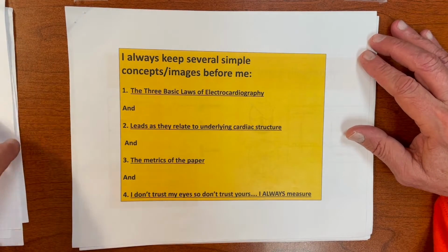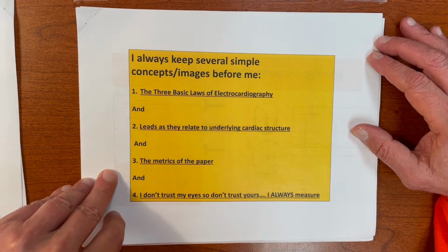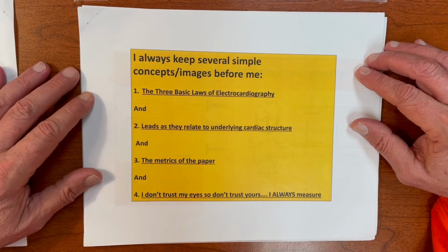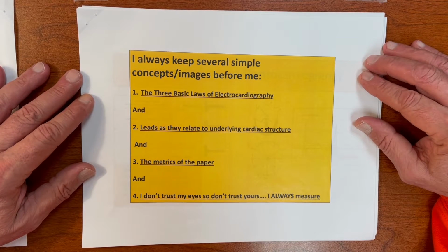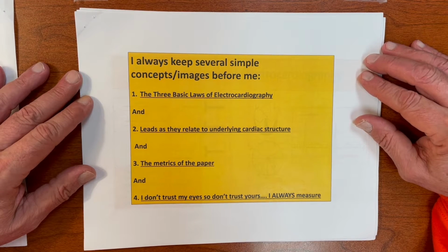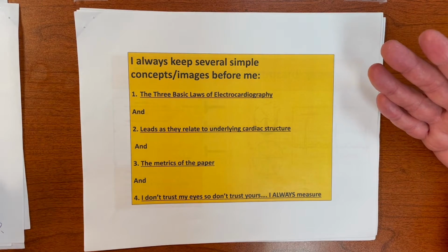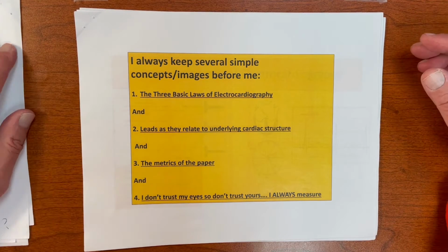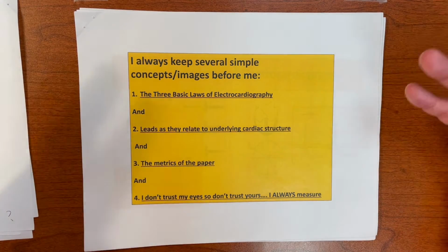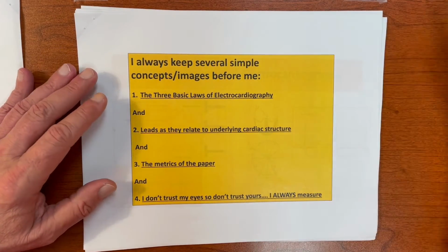So this is it, some very basic concepts. Not to insult anybody, but they actually are very, very simple. And I would actually suggest when you start thinking about EKGs and you're following me going through this, your intelligence and achievements are your worst enemy. Don't think too much, okay? You just got to think very simply, okay? The concept is, what do you remember better, a list of 100 items or a good conversation? So it's a good conversation always. So what we're going to do here is we're going to talk. You'll see we're going to use deductive reasoning using these concepts to come up with diagnoses.